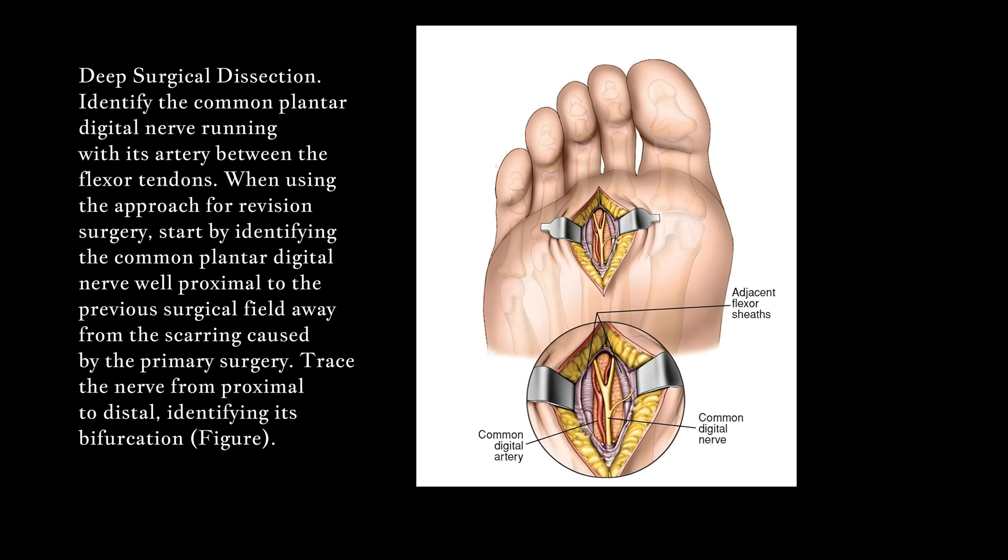Deep surgical dissection: Identify the common plantar digital nerve running with its artery between the flexor tendons. When using the approach for revision surgery, start by identifying the common plantar digital nerve well proximal to the previous surgical field, away from the scarring caused by the primary surgery. Trace the nerve from proximal to distal, identifying its bifurcation.